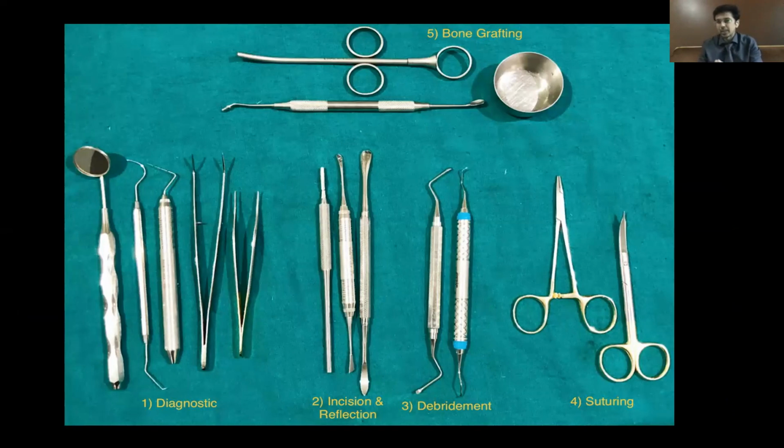Okay, so this is with regard to the surgical set, which all of you should be keeping before starting with this. A normal steel bowl, this is generally because the dappen dish many a times breaks if you are using wet autoclave for sterilization. So this is for placement of the bone graft as such.